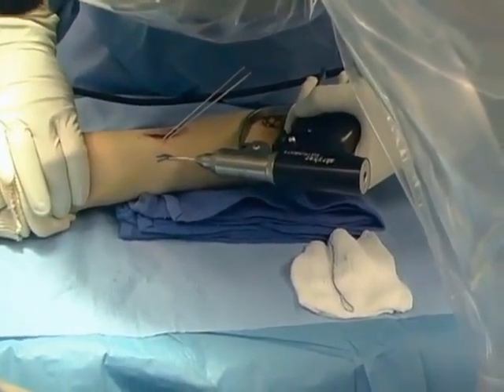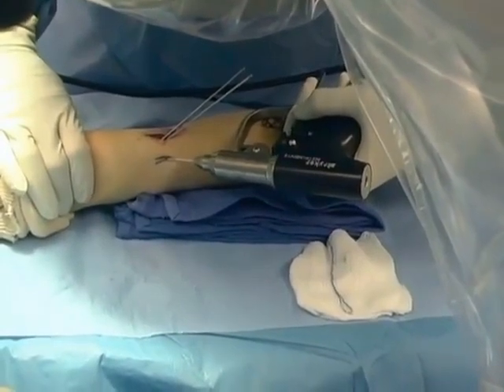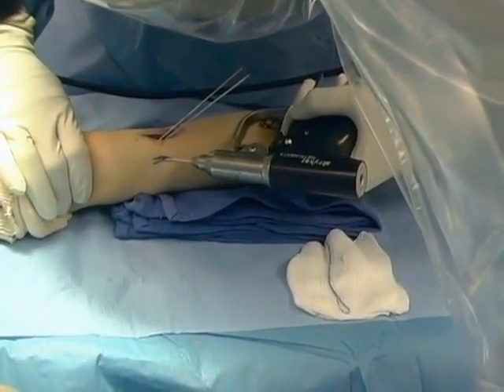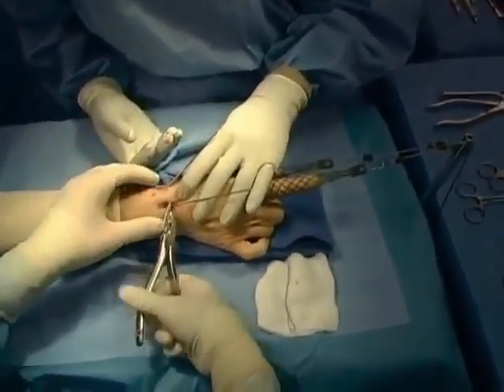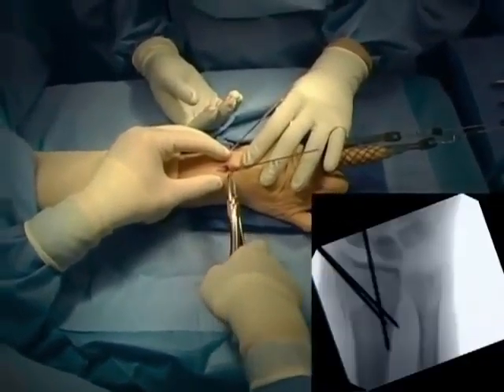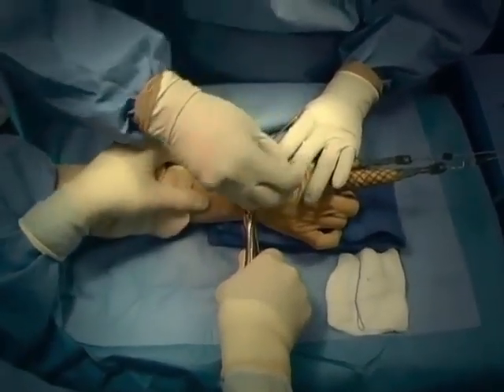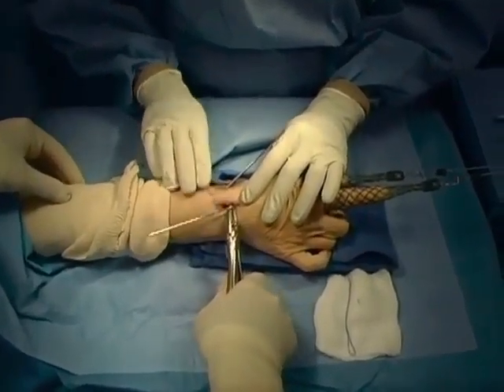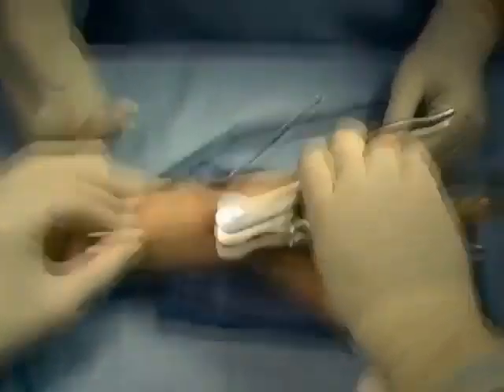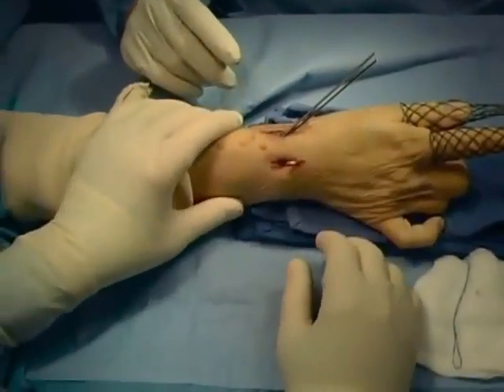Care is taken not to drive the pin much beyond the volar cortex because of the presence of the median nerve volar to the distal radius. The pins are bent superficial to the skin; we always leave the pins superficial for ease of removal. The radial wound is closed with absorbable suture so that the splint does not need to be removed just to take out non-absorbable sutures. At this point, the procedure for stabilization of the distal radius was completed and we proceeded to treat the scapholunate dissociation.